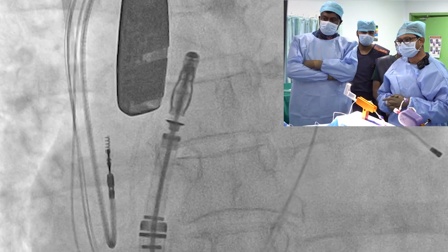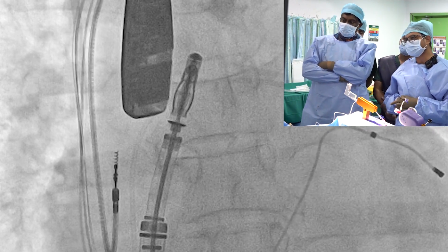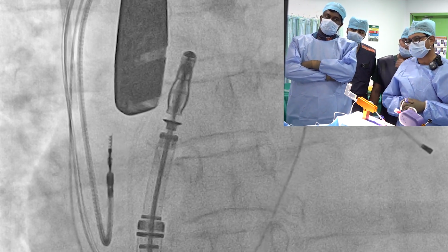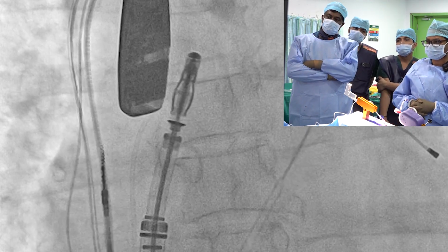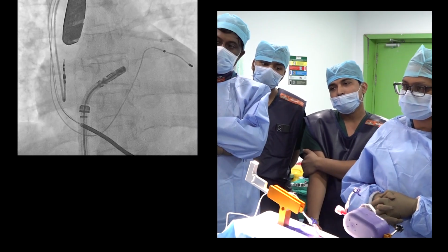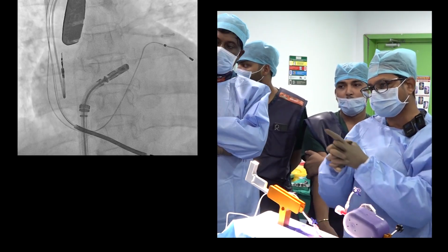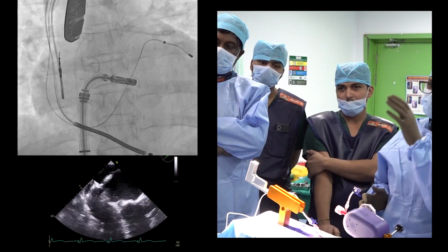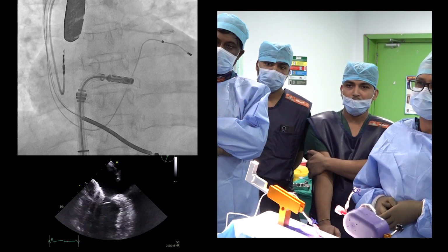So the next step is doing the sandwiching. Sandwiching is the method by which we are sure that our MitraClip system will not injure any surrounding structure. Once we ensure this sandwiching, we start giving M. M is just to give the curvature to the MitraClip delivery system. You can appreciate over here that we are giving M, and we are seeing the same thing in the two views. One is the bicommissural view, and then we have the LVOT view.